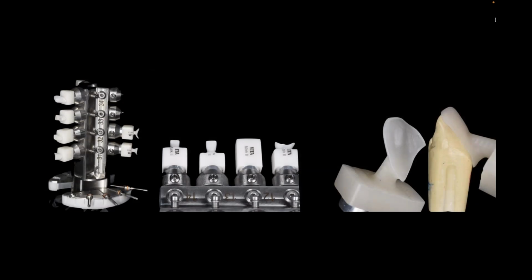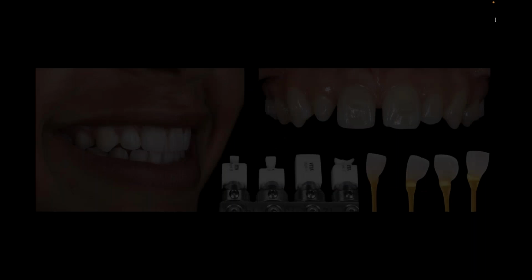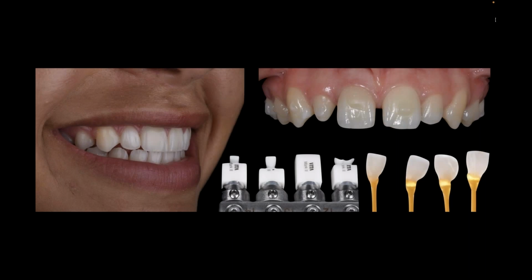And when I start to use these for window type veneers, like I just did on that young girl that you saw, and in that case was hand built, but sometimes now I can get away with not hand building it and using these press type veneers, or milled veneers, I should say, because they're actually milled ceramic is what they are. And I can utilize them just to fill the spaces that I want and then do the colorization on them, basically as a staining glaze technique.